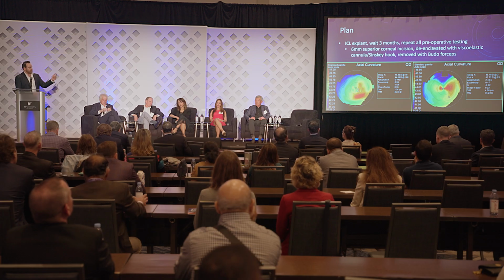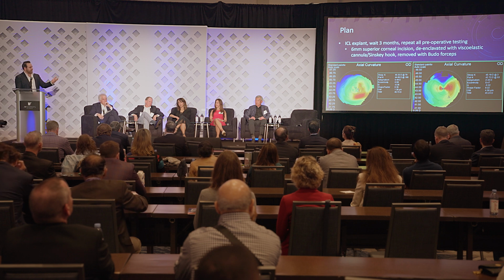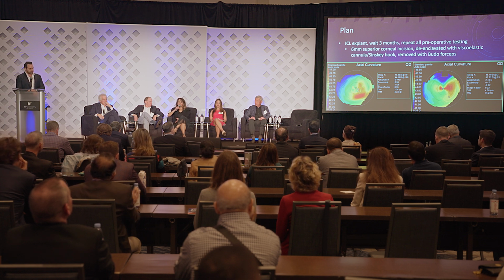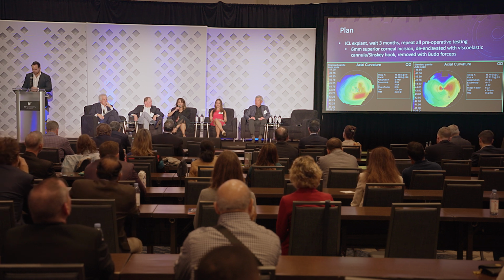We're thinking maybe we weren't thinking multifocal, we're thinking light adjustable lens there. How do you handle that much corneal astigmatism, when you've got maybe 3 diopters or so of correction with the LAL? We can still, as you know, with a light adjustable lens, adjust up to about 2.5 diopters of astigmatism. The challenge, though, is this is against the rule. There's probably going to be even more refractive change. And also the patient's very unhappy until you make that first adjustment, because in its virgin state, the light adjustable lens is a monofocal lens. So given how regular this topography is, I would probably lean more towards a toric monofocal to really give the patient that wow effect right off the bat.